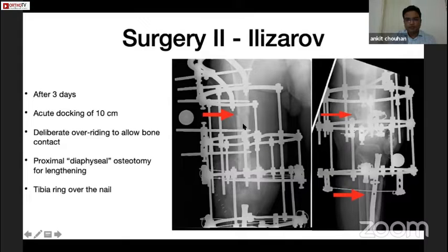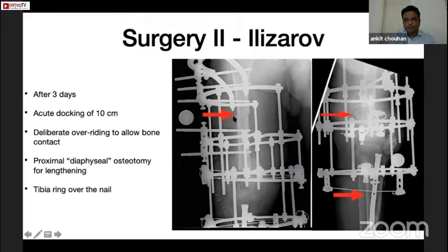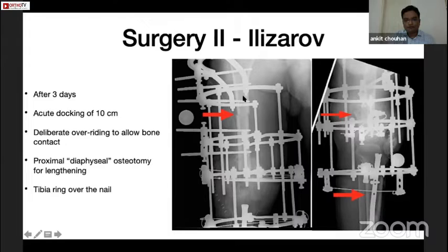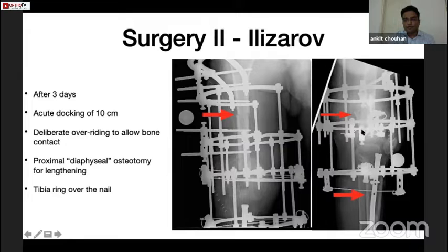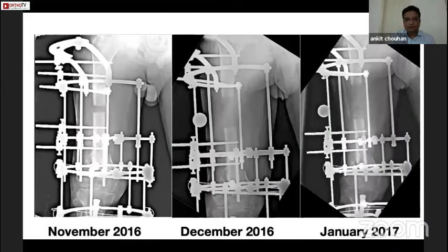The frame consisted of three rings in the femur, an arch proximally, and a distal tibia ring attached over the nail. I would like to point out a couple of things here. First is the location of osteotomy, which was diaphyseal as compared to a classical metaphyseal osteotomy. This was done to accommodate three or four pins proximal to the osteotomy because a very long distraction time was expected. Also, a deliberate overriding of fracture in the lateral view instead of aiming for cortical continuity was done to increase the contact area and increase internal stability.